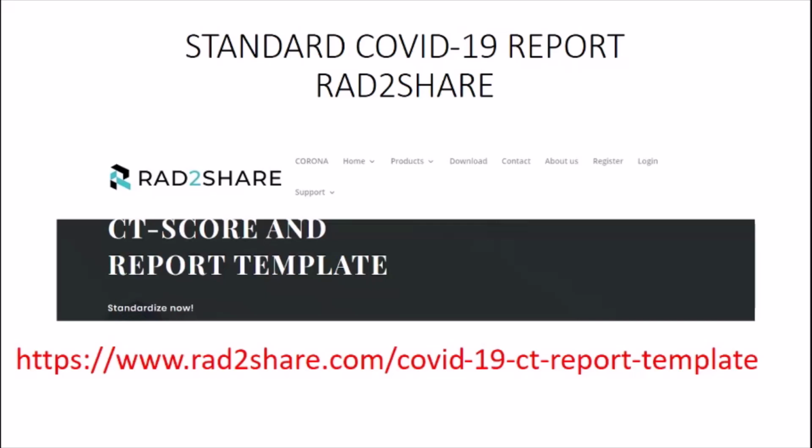This is a very, very important step. Imagine if all our reports regarding suspected COVID-19 patients or COVID-19 patients were standardized, so it's easy to check the follow-up, it's easy to communicate with the clinicians, and also to collect data and to publish research in the future.